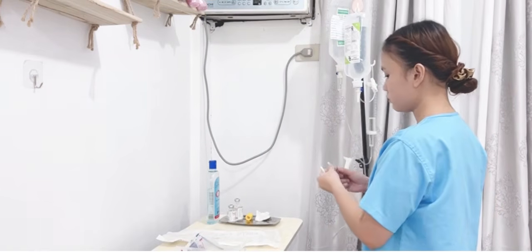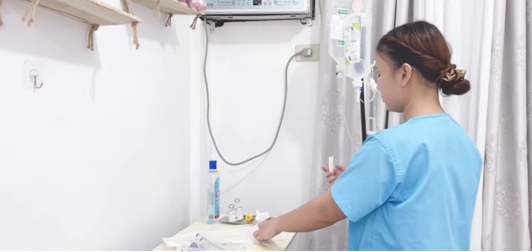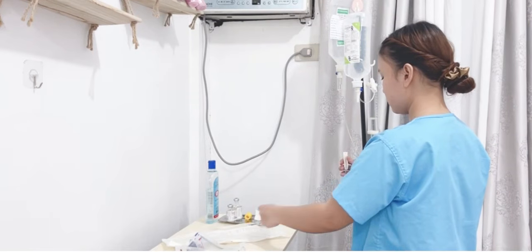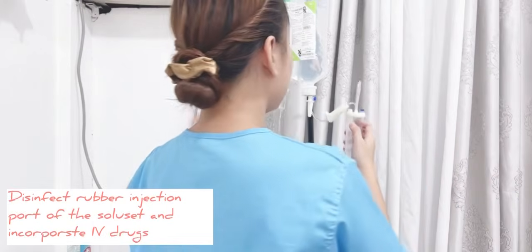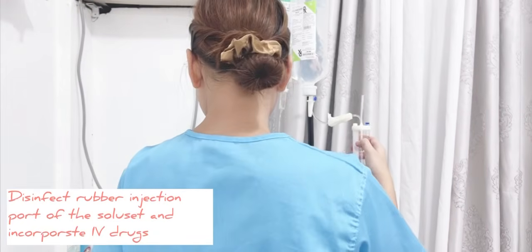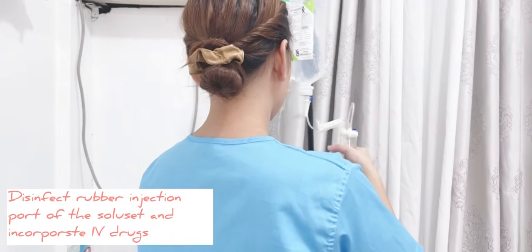Then remove the distal end of the Soluset. Then prime tubing. Then clamp tubing from the IV bottle and open the clamp of the airway at the Soluset to ensure delivery of medication. Then disinfect rubber injection port of the Soluset and incorporate IV drugs. It removes microorganisms that could enter container during needle insertion.